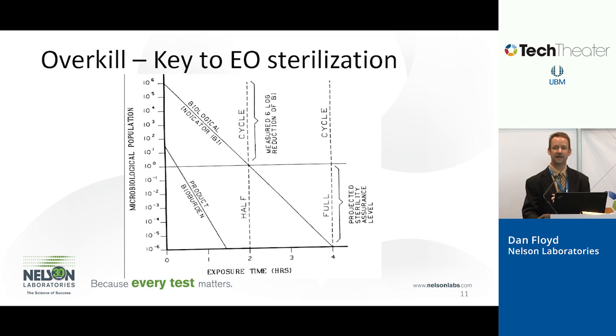Okay, we'll get into that in just a sec. The question was, how long does it take to sterilize? In just a second, we'll show you how we go through and actually determine how long. The answer for that really depends on the product and the load itself. It varies across a lot of different times.